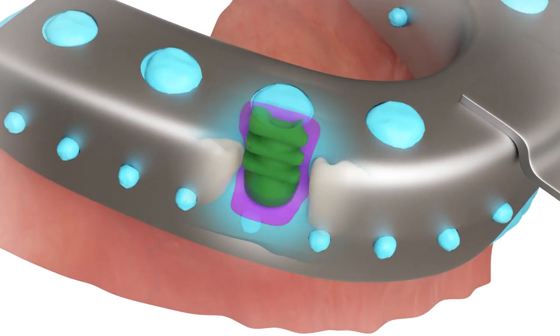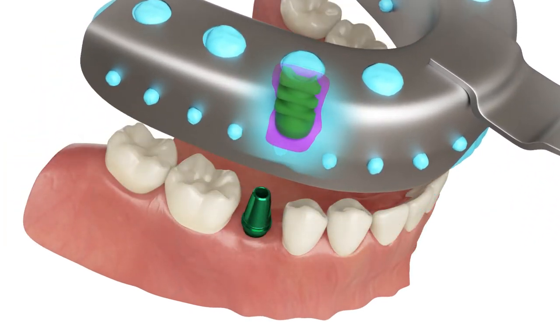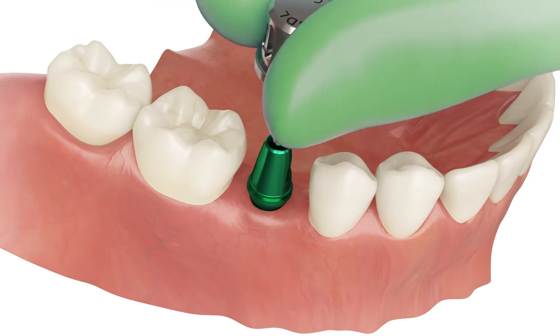After the impression has dried, remove the impression with the transfer cap inside. Unscrew and remove the transfer.